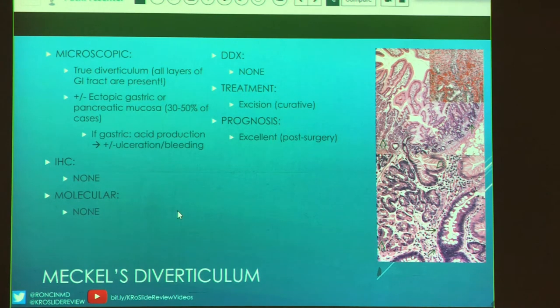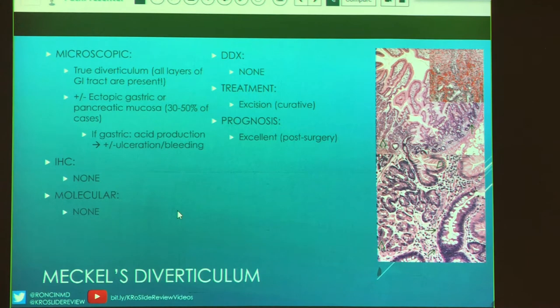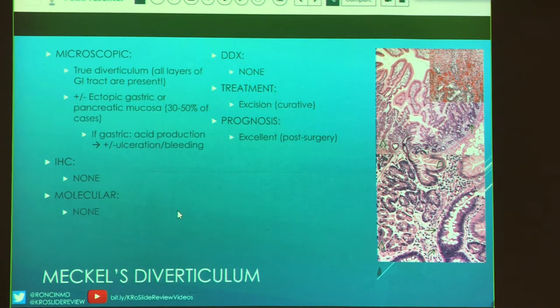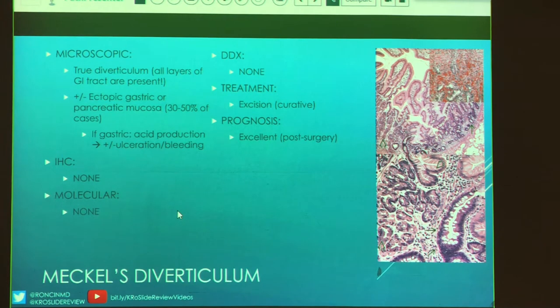There's no IHC or molecular testing needed — it's normal tissue, just in the wrong location. There's no real differential because it's not normal and not in a location you'd expect. Treatment is surgical excision, which is curative; these don't recur and prognosis is excellent post-surgery. The gross and microscopic images show gastric and intestinal mucosa delineation, and the inset suggests possible pancreatic tissue as well.